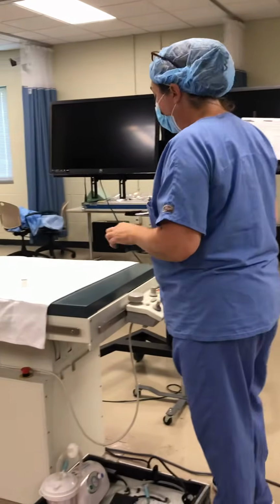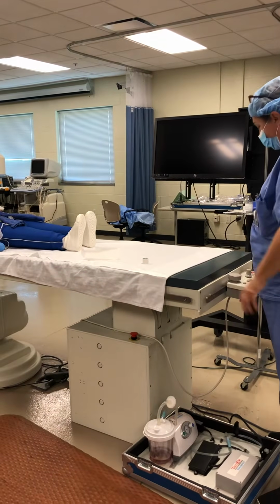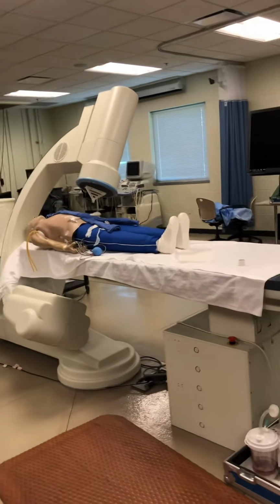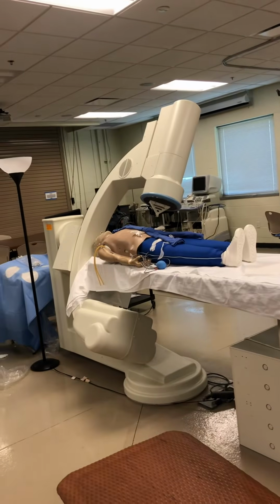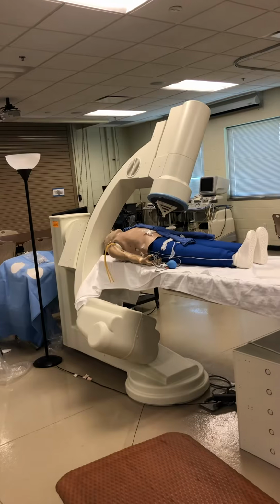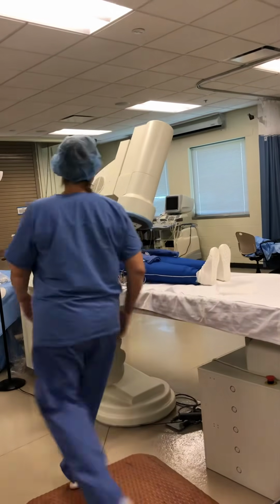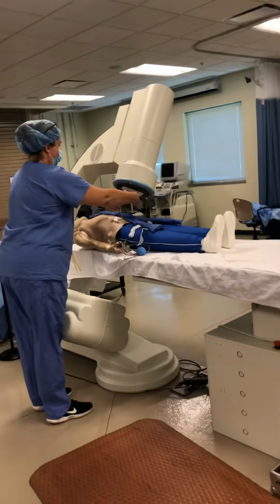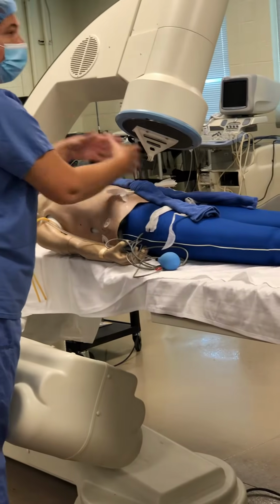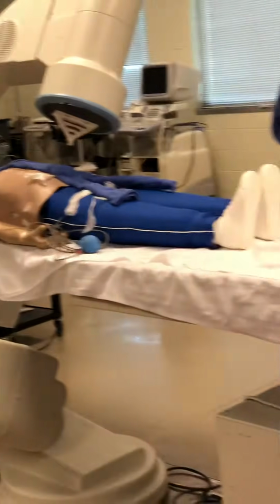Now when we go to the right renal, that's when we do LAO 15 to 30 degrees. And anywhere in between there is going to be fine. Okay? We also would want to try to center our image so that we get the whole renal, whole kidney, and we see, of course, the takeoff, and it's a nice centered image for that picture.